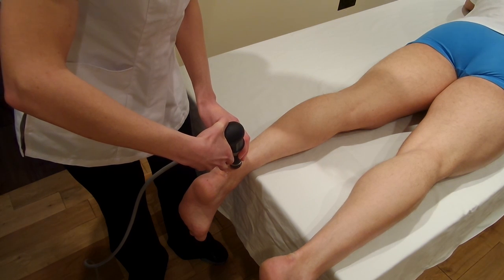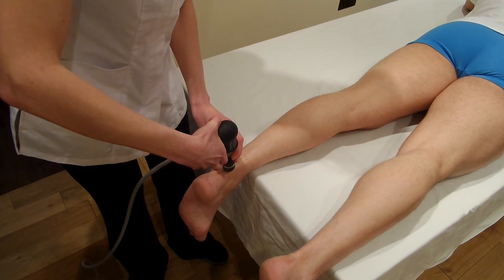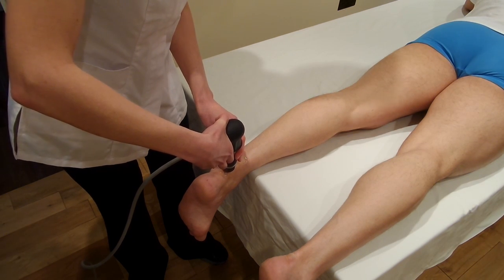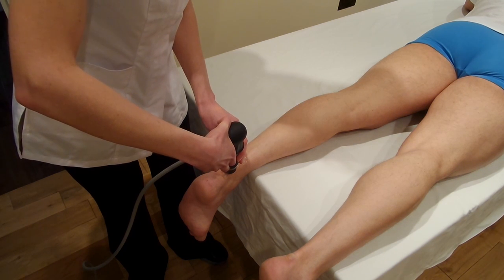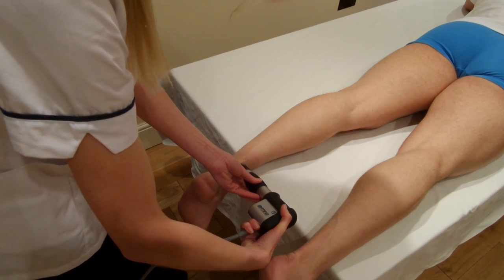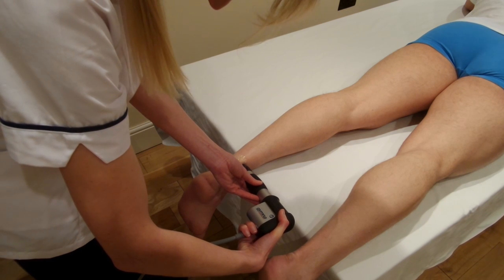Here we are on the second spot coming down through the Achilles tendon. You can see the treatment is going straight down through. There will be a third spot here now. Before we move on to the medial aspect of the Achilles tendon, we'll finish shooting three spots of 200 shocks from this outside edge.